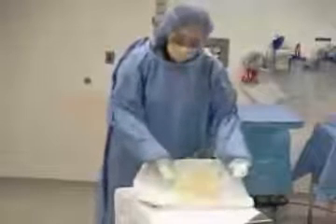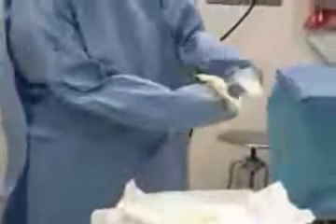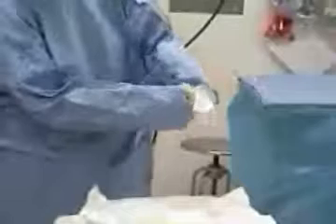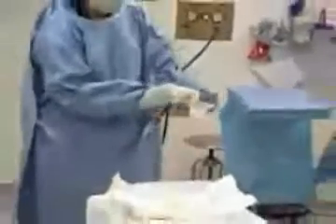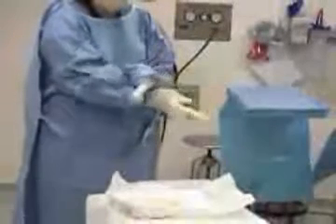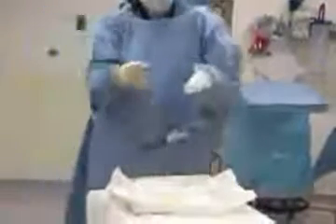Now, in the packaging, can you see the thumbs? There's the thumb here and my thumb for my right hand is here. So I place thumb to thumb, and the cuff of the glove — the inside cuff — matches the white cuff on the gown. I grab hold of the cuff of the glove with my right hand, and do the same on the opposite side of the cuff with my left hand. I open it up and as I'm opening it up, I'm pushing my right hand through the cuff and putting my glove over my fingers. Notice that my hand never came through this cuff, and it should never come through the cuff until you have the glove over it.